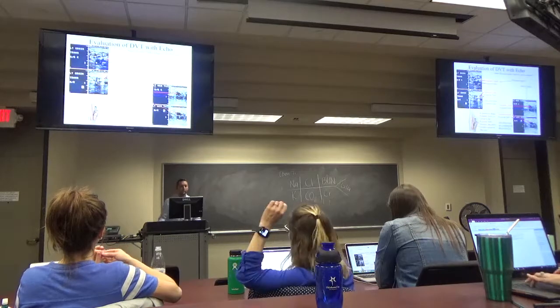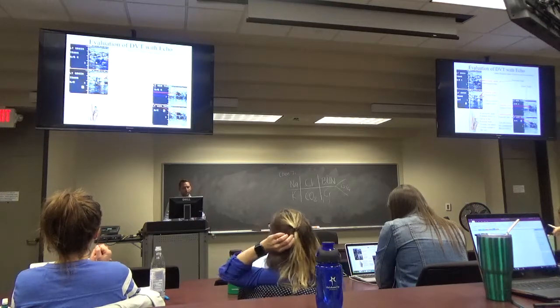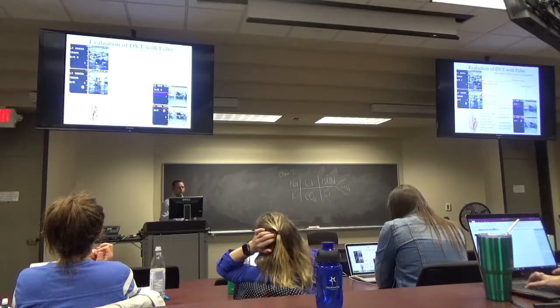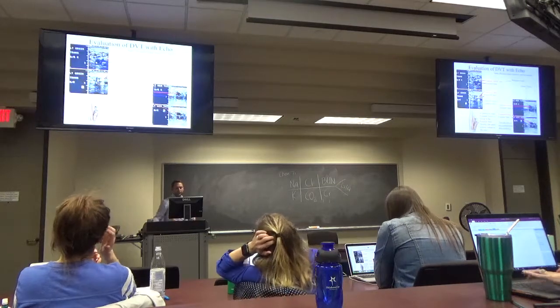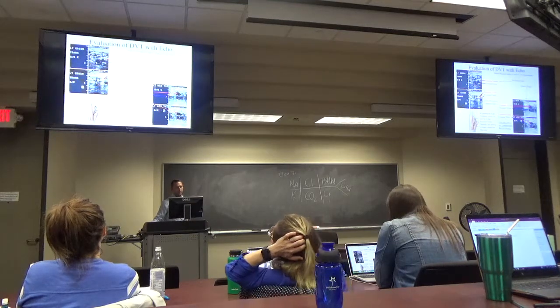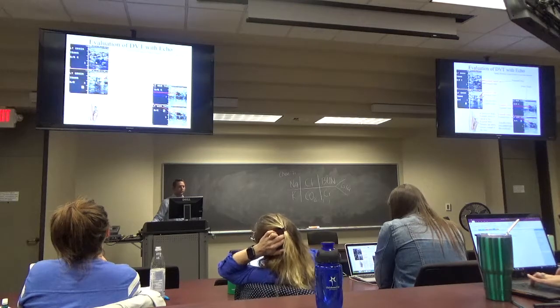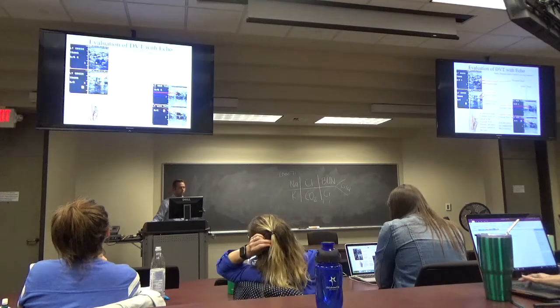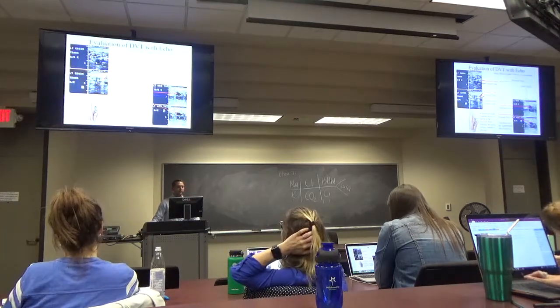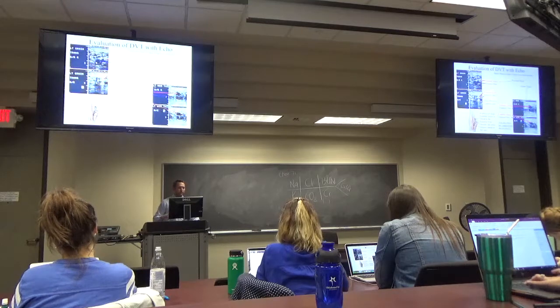So, evaluation of a DVT with echo. This is what you do after a pulmonary embolism, or someone has something like that. On the upper left, you see the femoral artery on the right and the femoral vein to its left. As you can see, the ultrasound tech takes the probe over the femoral artery and the femoral vein, and they try to compress it as much as they can. The artery is not really distensible, it's thick-walled, so it doesn't compress, so it's right here. But the vein itself does compress. So they'll do that on all the different deep veins of the leg.